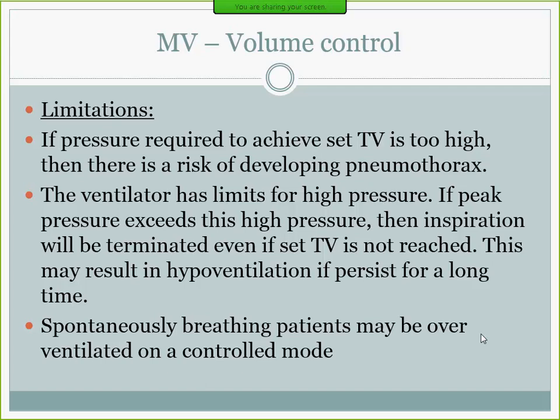If the pressure required is more than a certain number, more than 50, 60, whatever the therapist sets the machine to, then the inspiration will shut off suddenly. The patient will not get the full inspiration, but at least you will not create a pneumothorax. On your pressure volume curve, you are preventing over-distension of alveoli by controlling the pressure. So it's a safety feature in volume control mode.